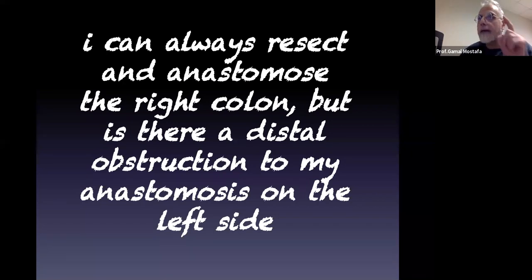Do you see how many answers, guys, CT with rectal contrast provided you? So many, regardless of the cause of obstruction, the degree of obstruction, proximal, distal, right versus left. Huge light coming up to help you diagnose these. Don't work in the dark.